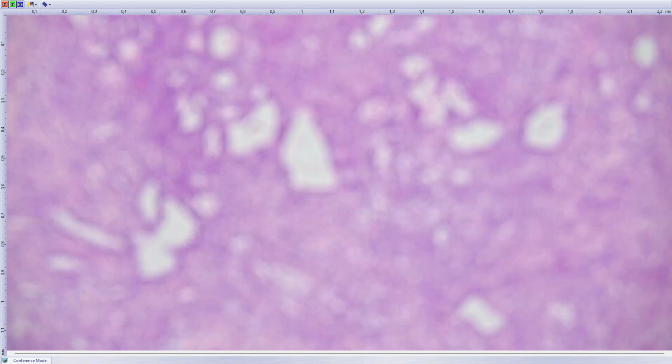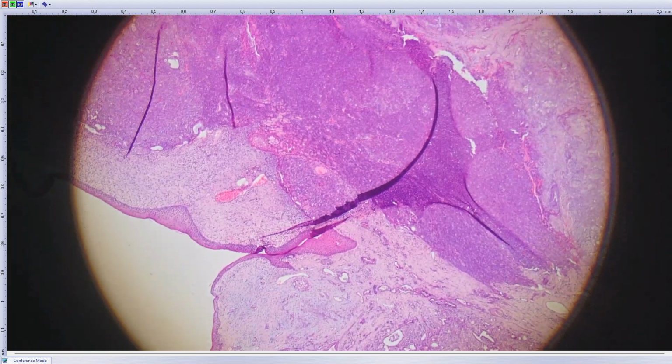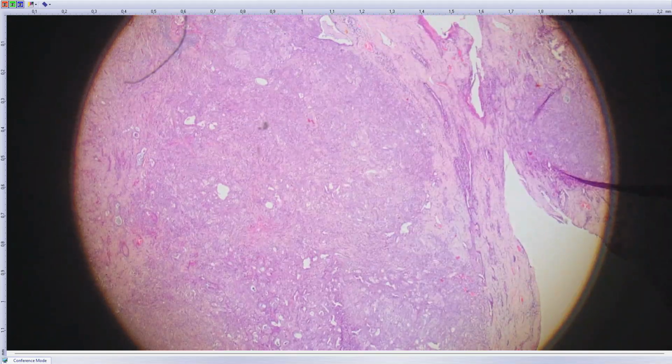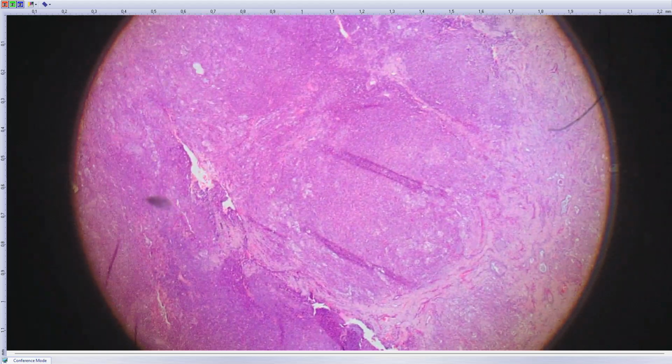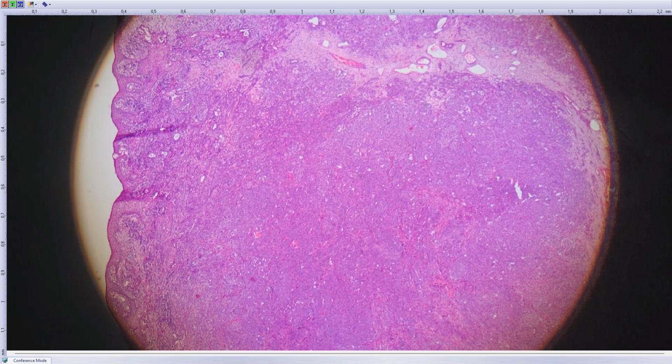Another case is a tumor of a newborn patient in the nasopharynx. We are now finishing a paper about this very enigmatic type of lesion. The tumor typically has two components.